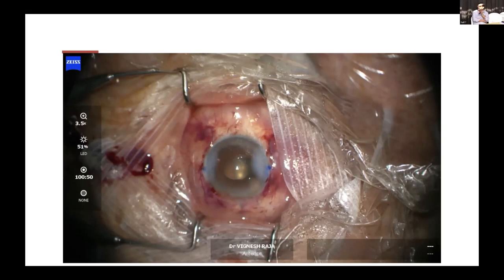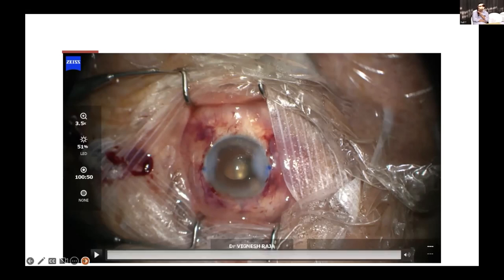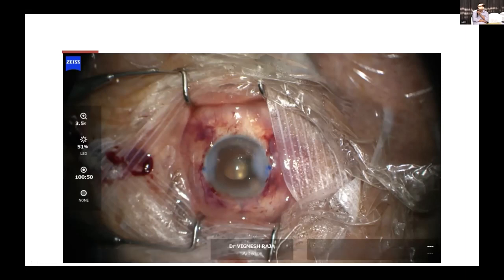Okay. And so there is no need for an iridectomy, is it not? Some opening on the iris, no? No need for iridectomy, because one, it's a completely vitrectomized eye, so there is no vitreous to cause pupil block. And second, there is a lot of space for the aqueous to move around, because the edge is always free. The edges are not stuck anywhere. So there will definitely be a gap between the edges.